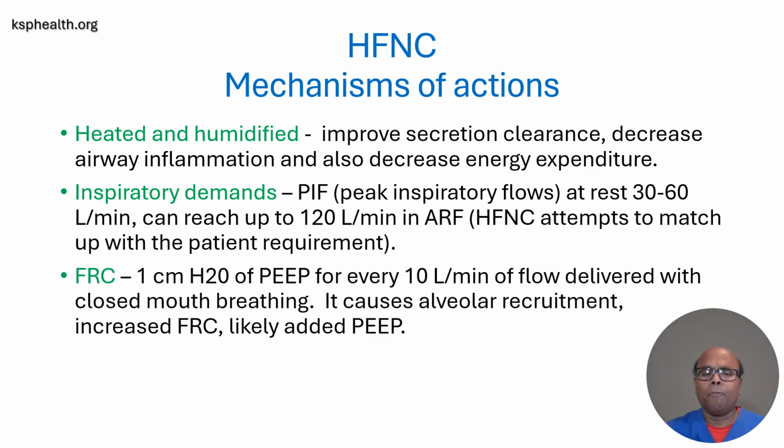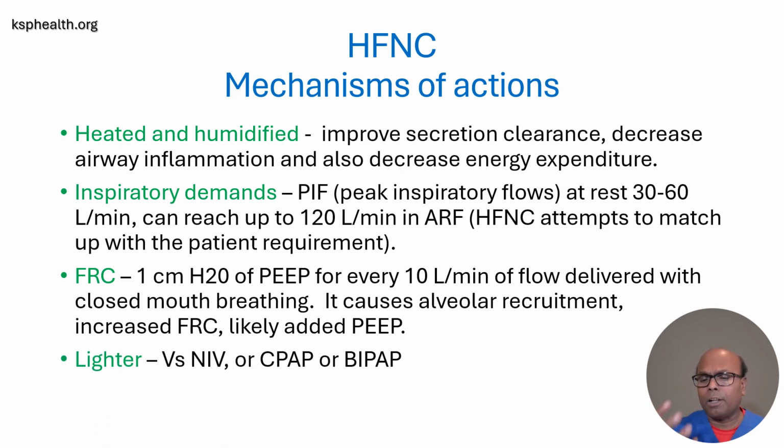It also improves functional residual capacity. This is adult data. For every 10 liters per minute of flow, it increases PEEP by 1 centimeter. For example, if the patient receives 60 liters per minute, they get 6 centimeters of water of PEEP. It causes alveolar recruitment and increased functional residual capacity, most likely because of the added PEEP. It's lighter. It's just a nasal cannula. It is not the face mask or nasal mask that children and patients do not like to have on their face.